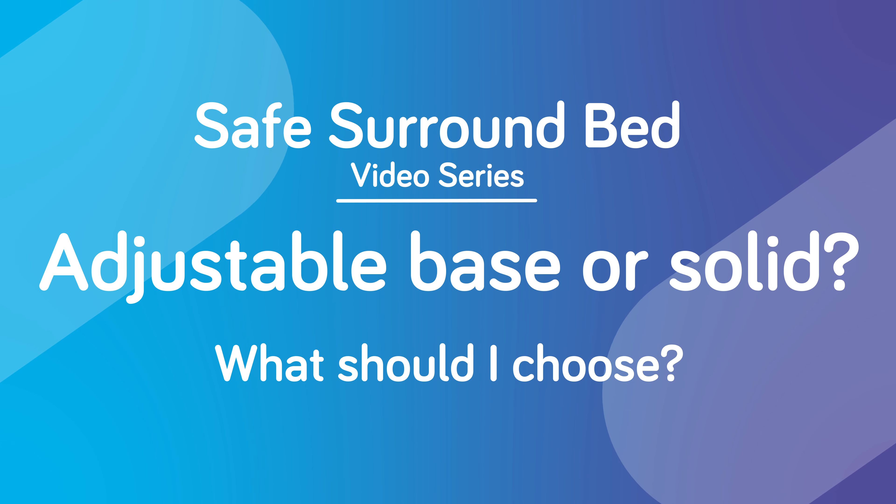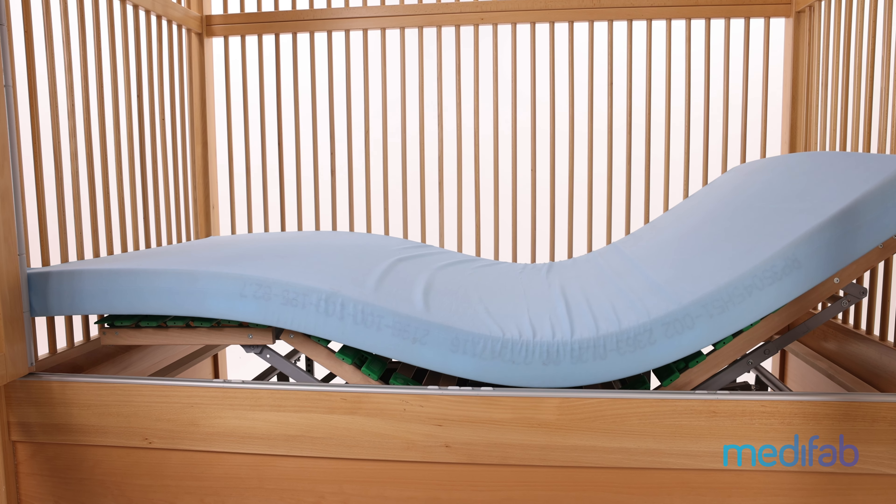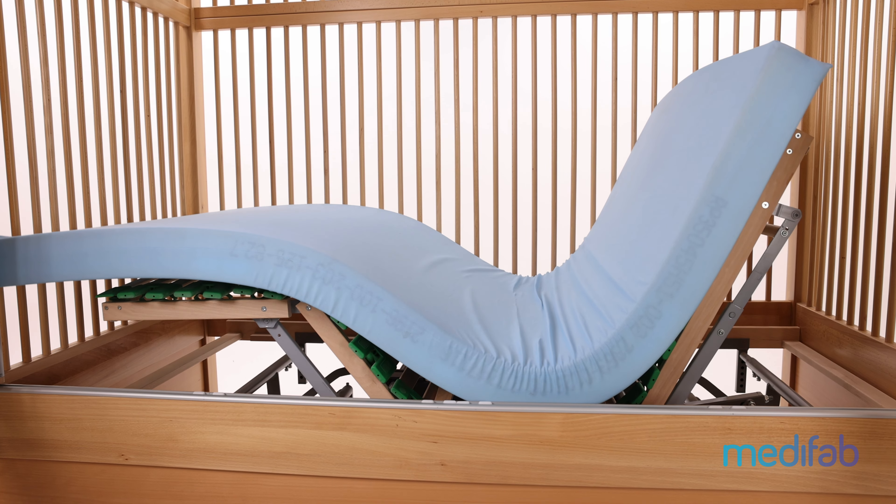The Safe Surround bed has a profiling base as standard. This allows the head and the legs to be elevated, which can be operated either together or independently like so. This is especially helpful for some users who require this elevation for feeds or respiratory requirements.